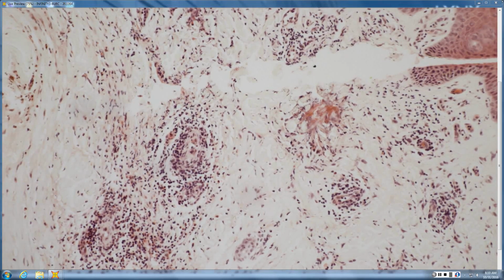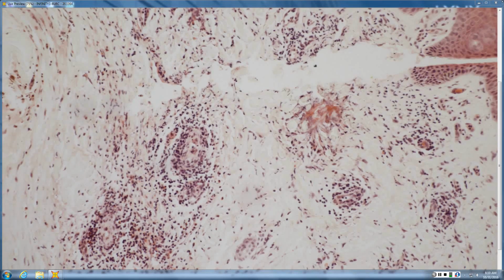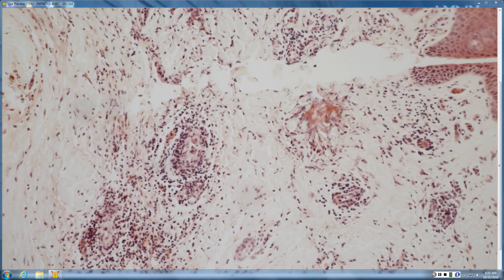Churg-Strauss. Yeah, exactly. Churg-Strauss granulomas start looking just like Wells flame figures, but then they form granuloma around those flame figures. So early Churg-Strauss can be just LCV with necrosis of vessels, superficial and deep, can be flame figures that start to form granuloma around them, or can be a true eosinophilic vasculitis. Any of those can be what you see early in Churg-Strauss. And it's important because it beats pretty hard on both kidneys and heart.